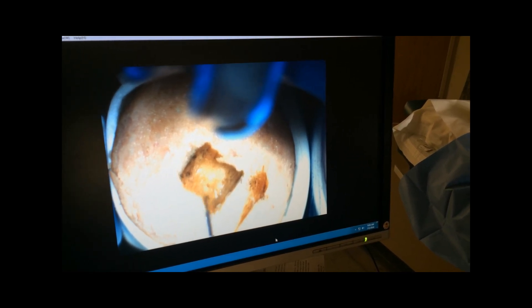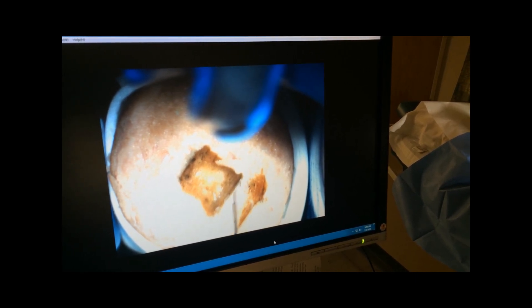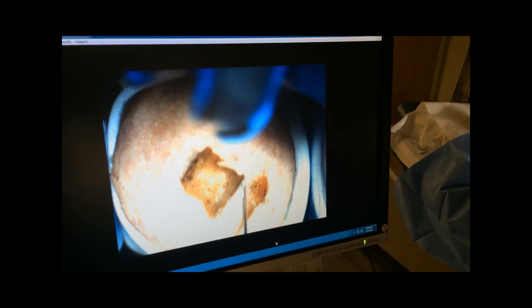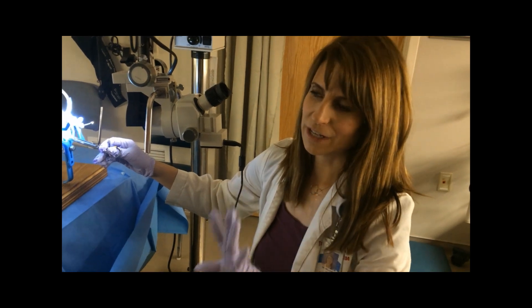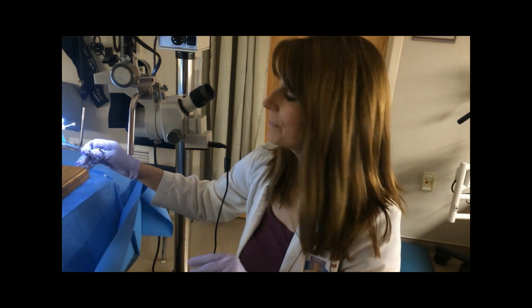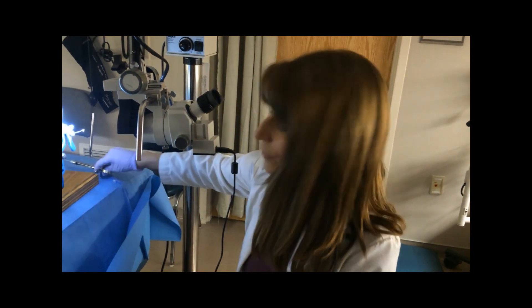I find doing resident education that I want to make sure that the patient is very numb. At times, depending on where the squamous columnar junction is, some of the lidocaine will actually come out through the columnar cells. That's why I want to make sure that the patient is completely anesthetized. They do very well with this — it doesn't seem to bother them or seem that uncomfortable to be numbed.